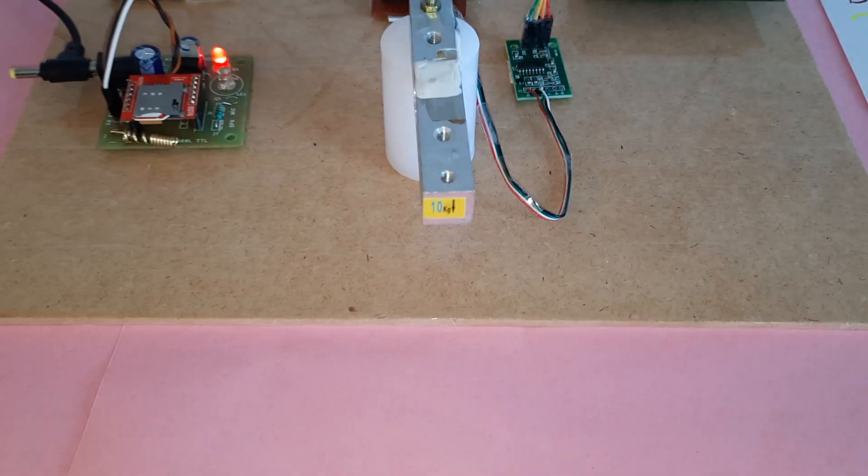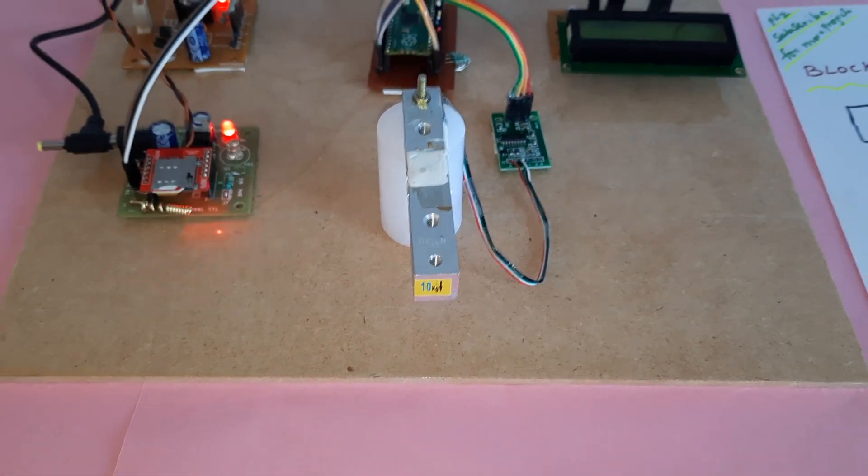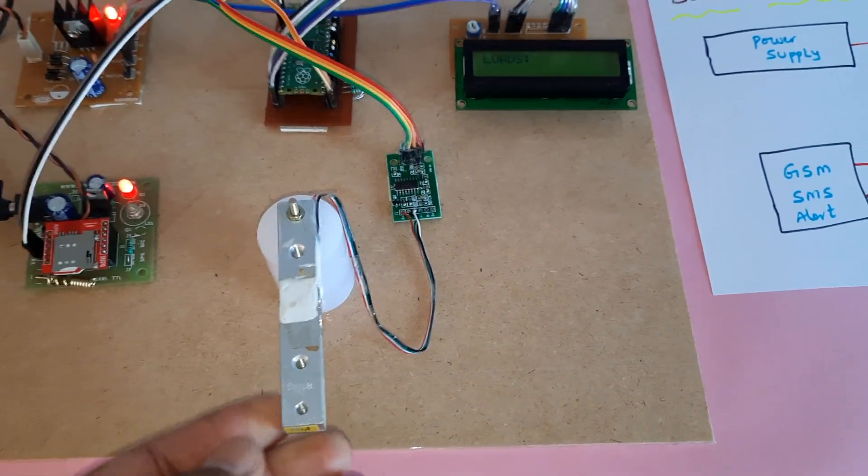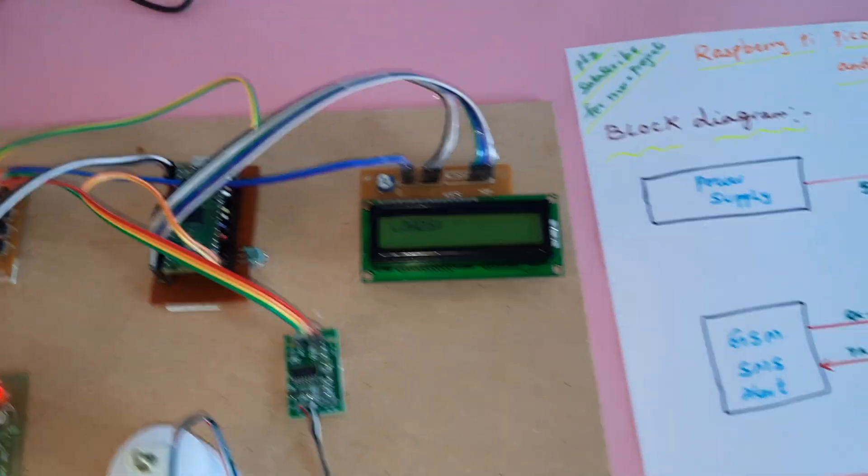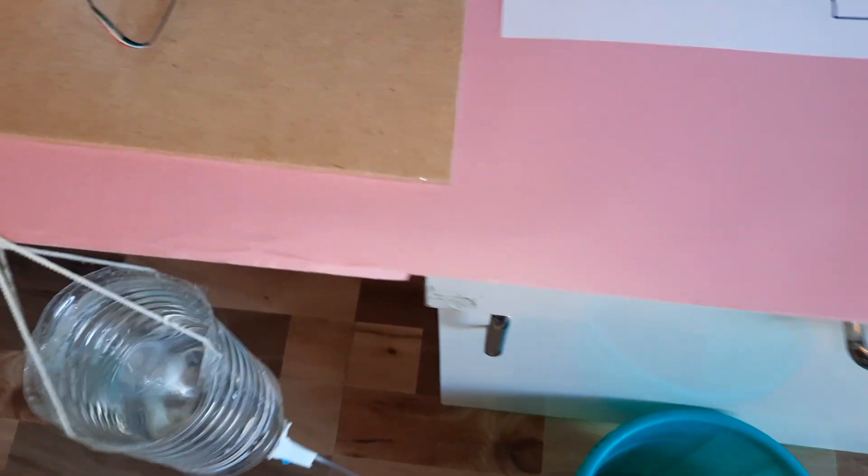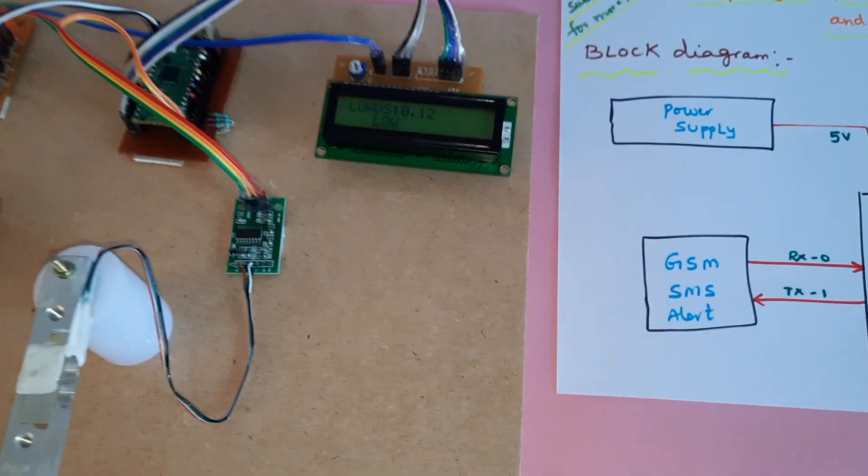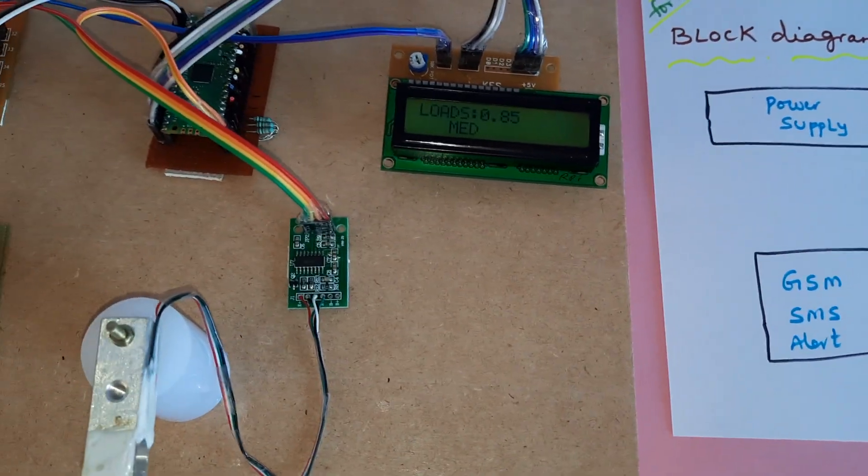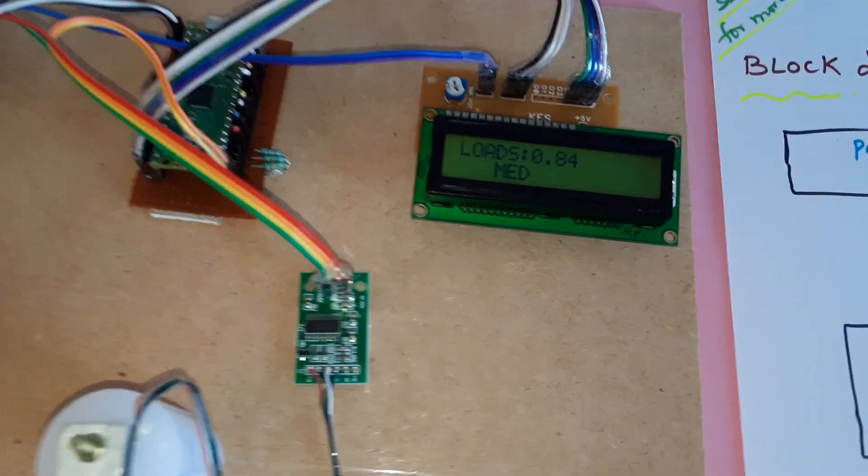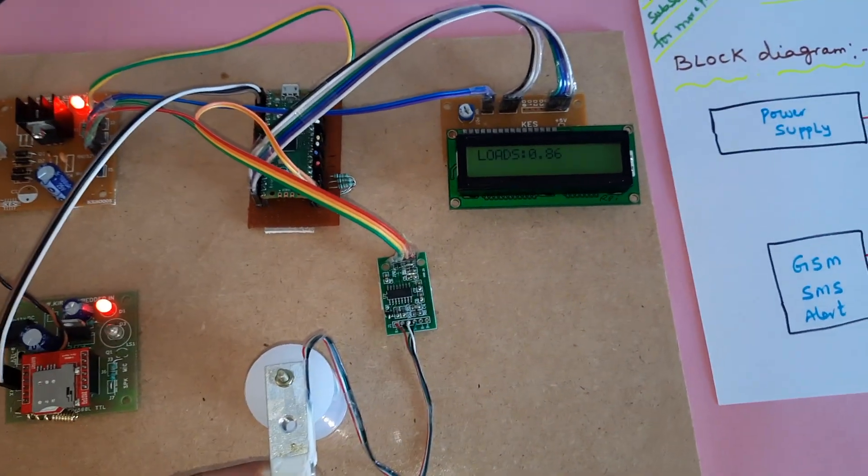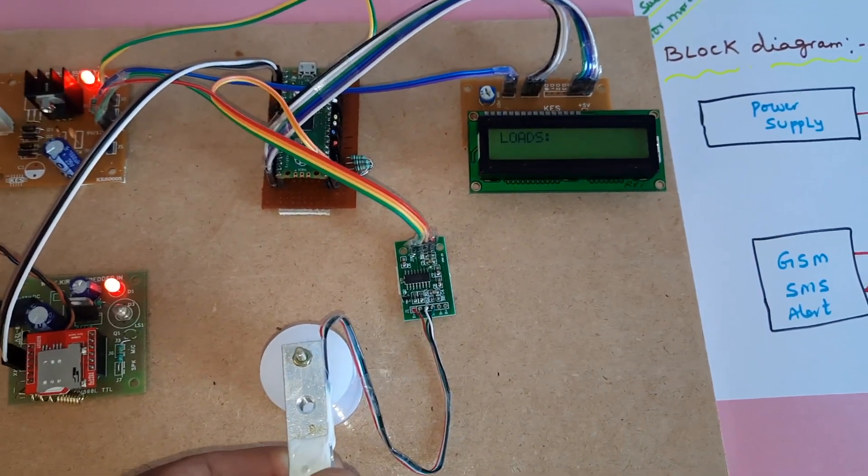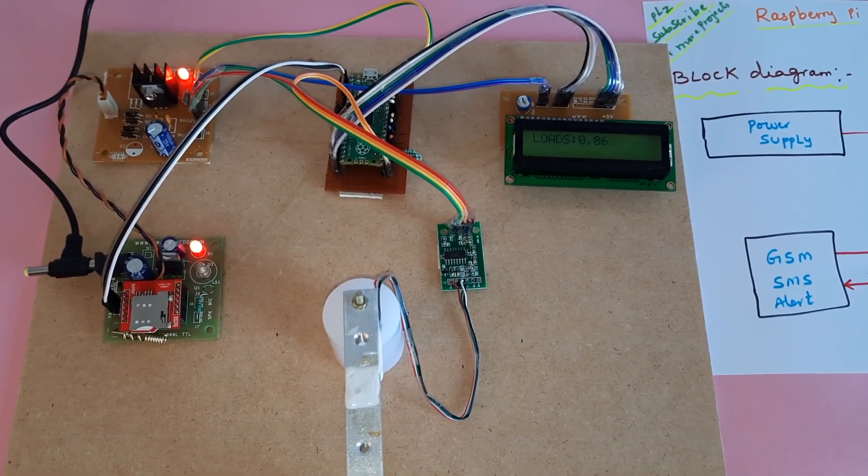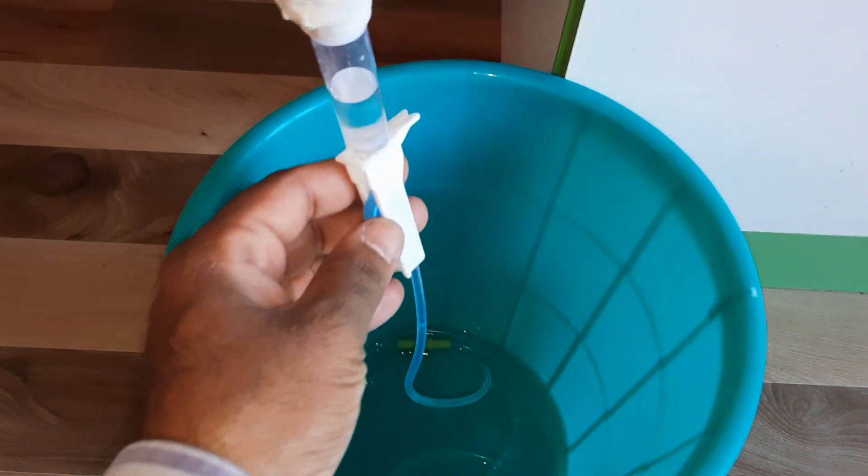Right now, there's no saline bottle connected. Now I'm taking one saline bottle and placing it on the load cell. The load shows 0.85. If it reaches 0.9, it will register as full.